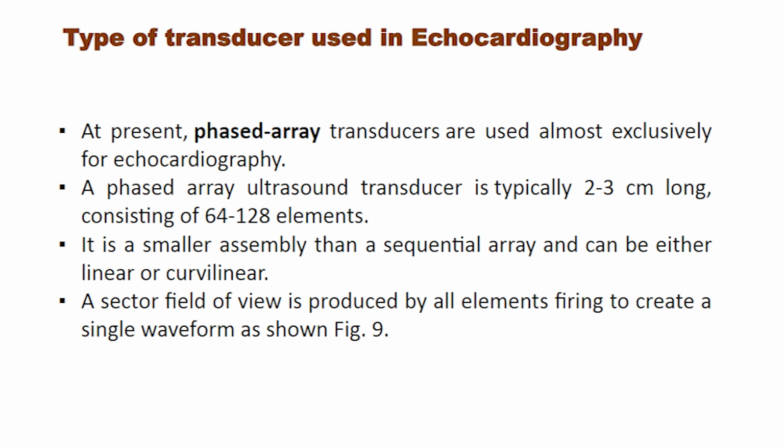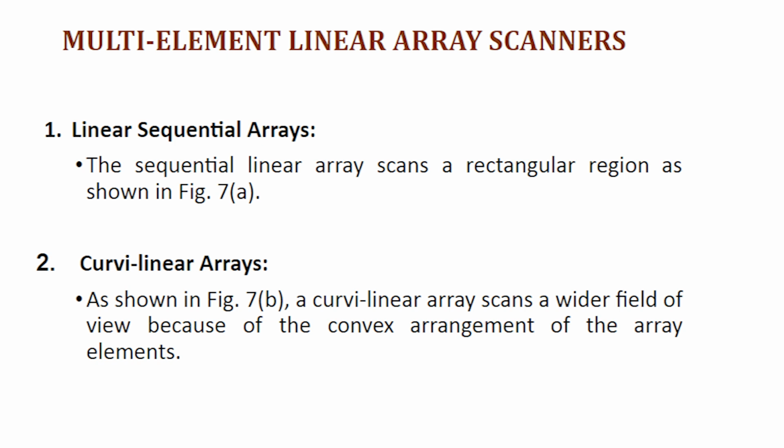A sector field of view is produced by all elements firing to create a single waveform as shown in figure 9. Now we will see multi-element linear array scanners. First one is linear sequential arrays.